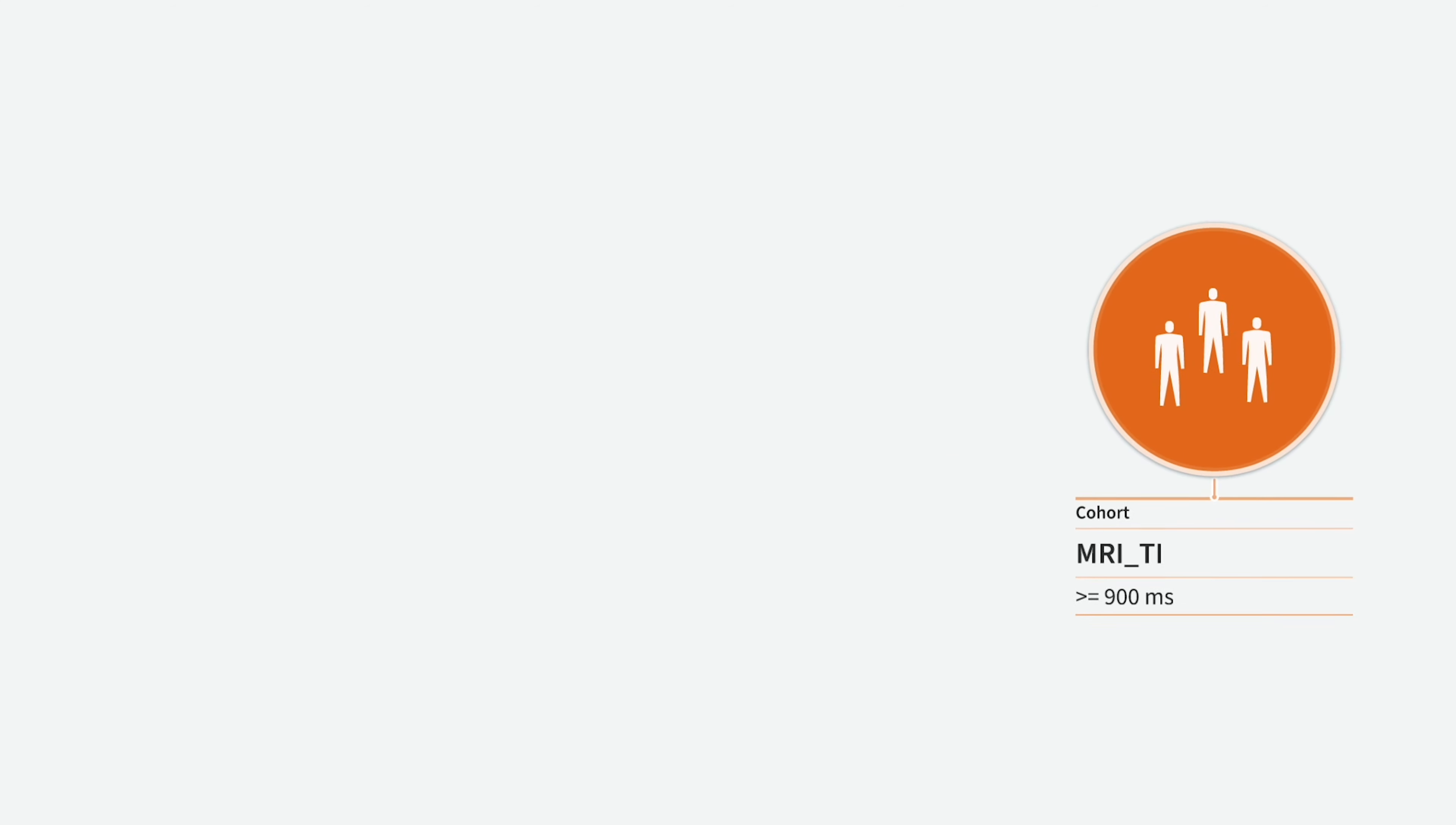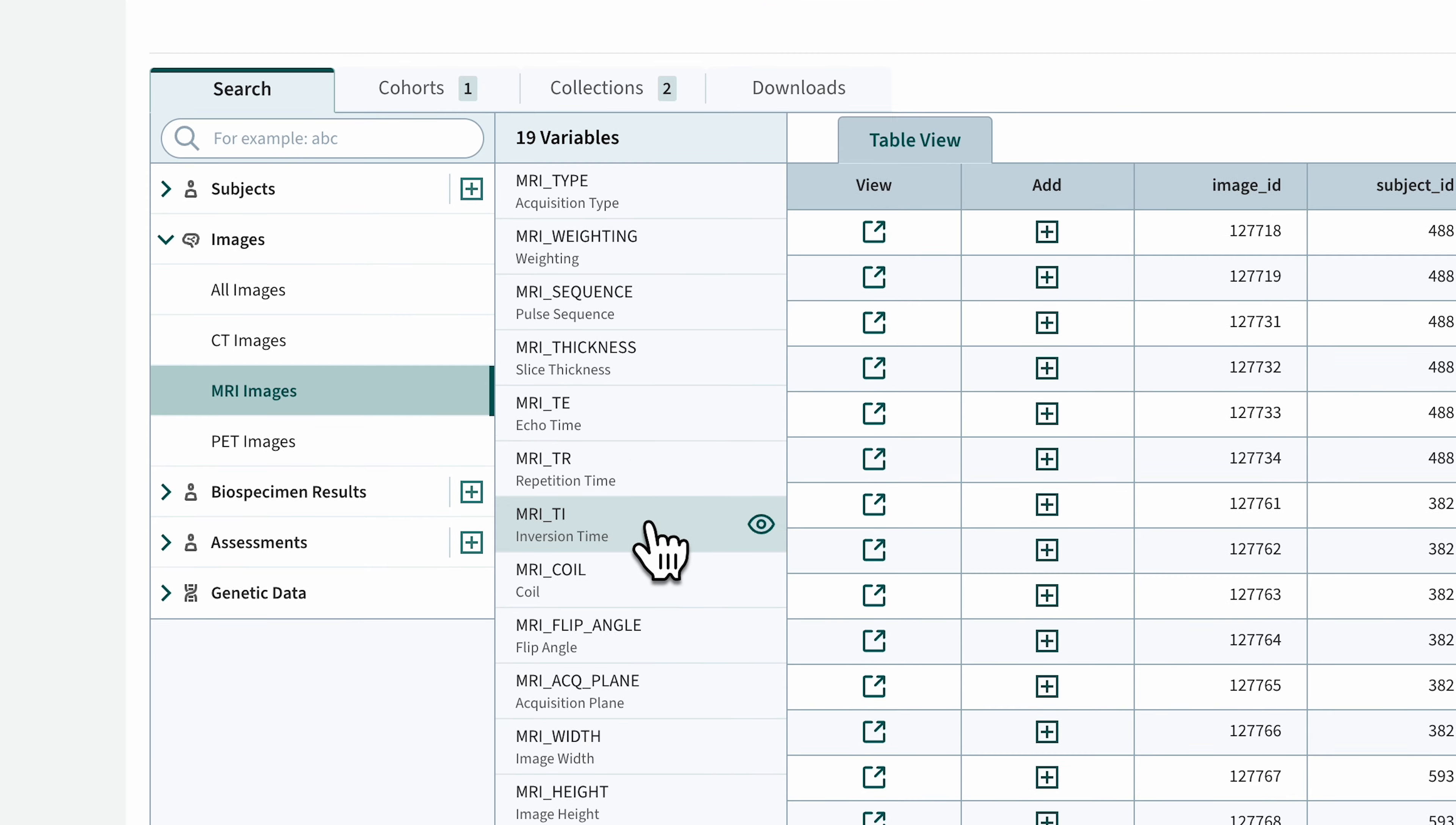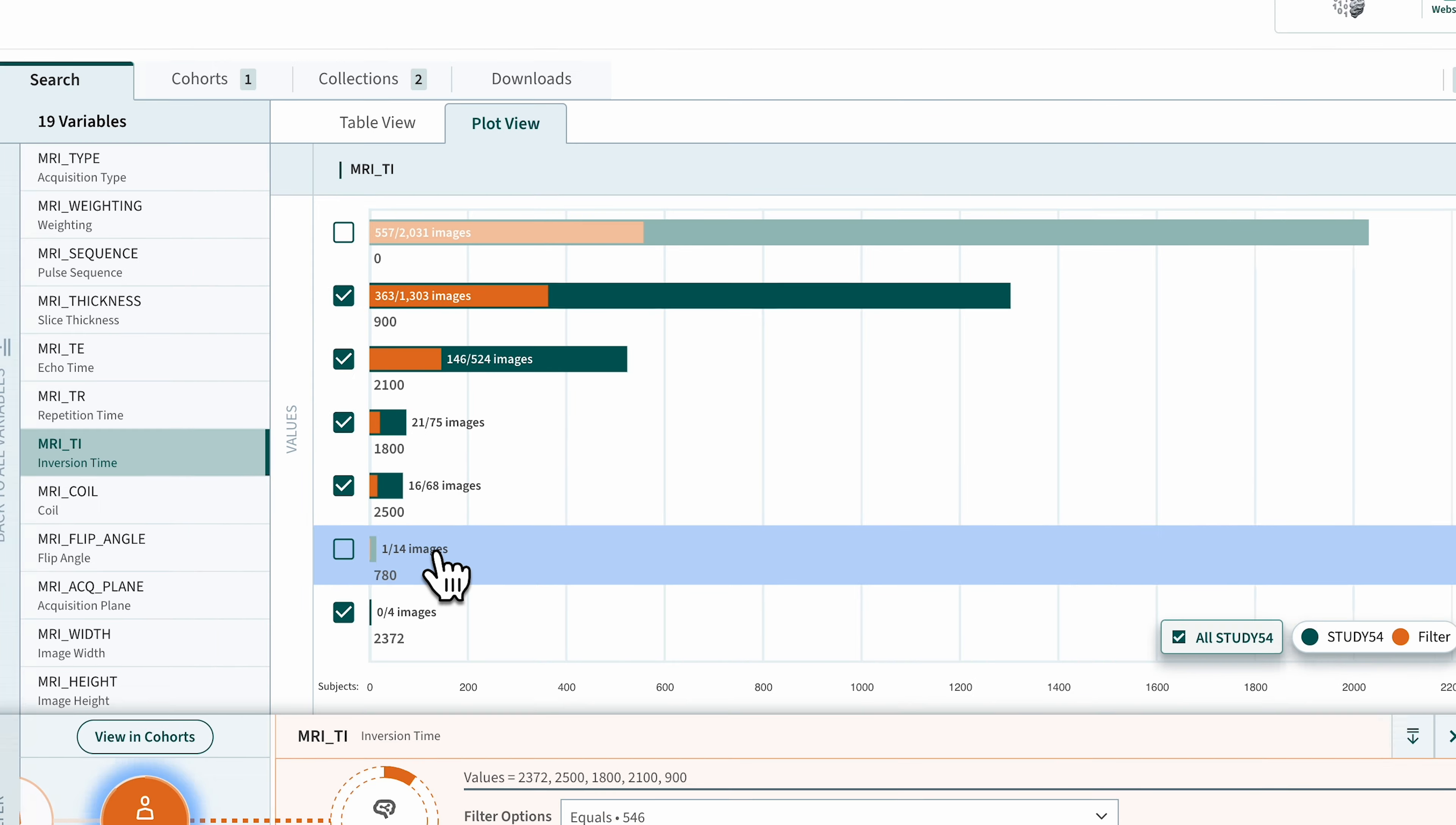First, we will add a filter for inversion times equal to or greater than 900 milliseconds. Click the plus button after the last filter. Choose the MRITI variable in the MRI Images table under the Images category. Uncheck all inversion times less than 900 milliseconds.